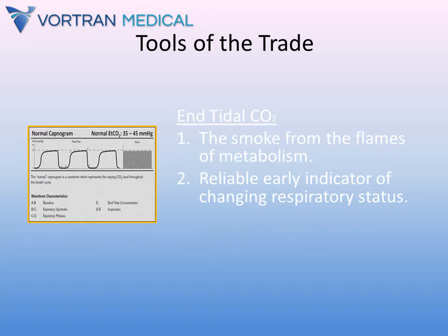End-tidal CO2 monitoring allows us to see in real time the effects of each breath we give to our patient, and is an early indicator of respiratory status changes to come. It is important that we begin CO2 monitoring as soon as possible, even before intubation, through non-invasive cannula monitoring.